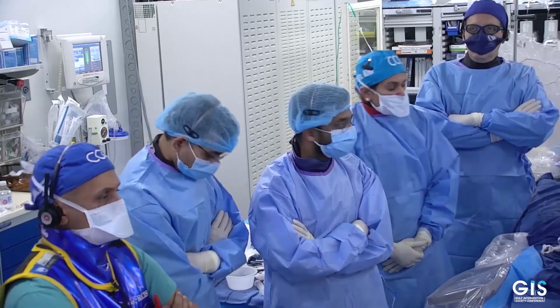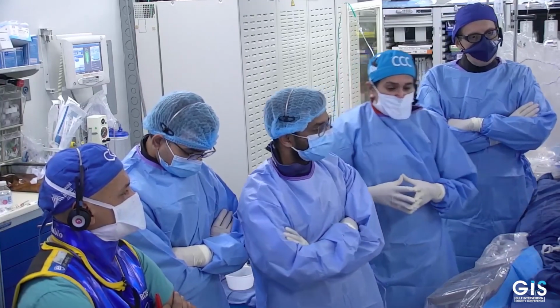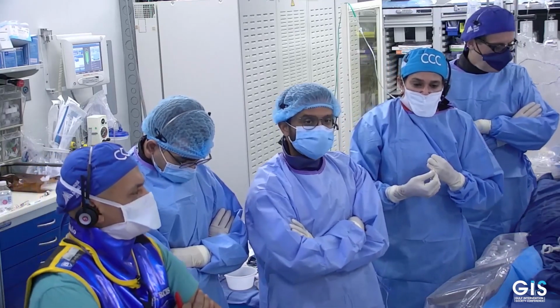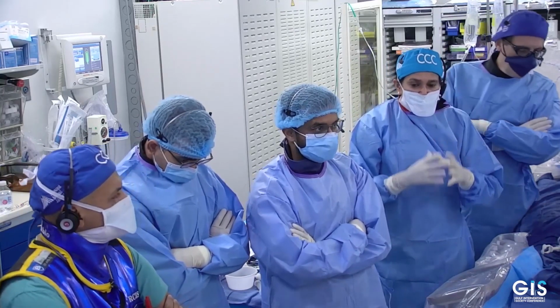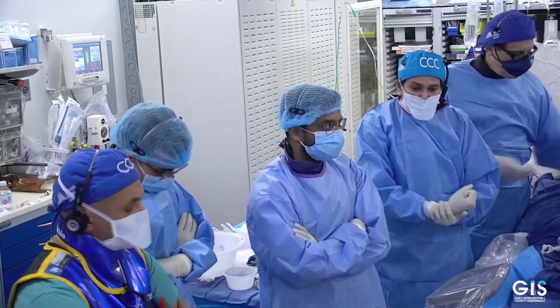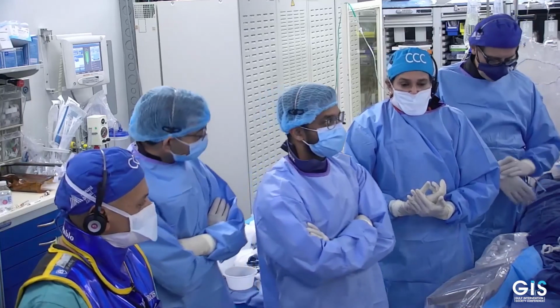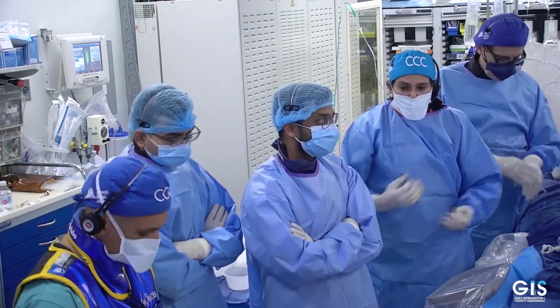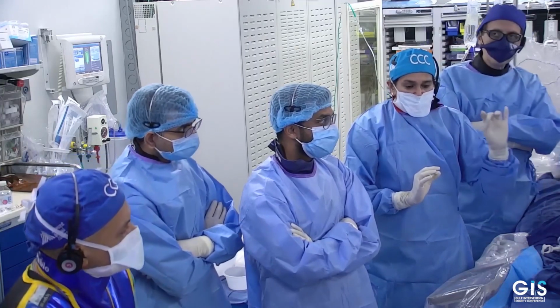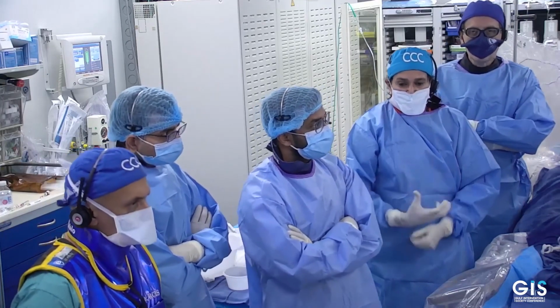I want to say something, a comment made by people about the LV gram. So I just have to go back to that question which Dr. Dangus already told you. Yes, we use an end hole catheter which is JR, but it is not by using an injector. It is by hand injection, 5 cc done with our hands. In Mount Sinai, we have done over 300,000 LV grams. We have been doing this over 15 years with no complications. So as long as we know that you have a good LV pressure, there's no damping of the LV pressure like we do any coronary injection, and you do a hand injection, it is a safe way of doing an LV gram.